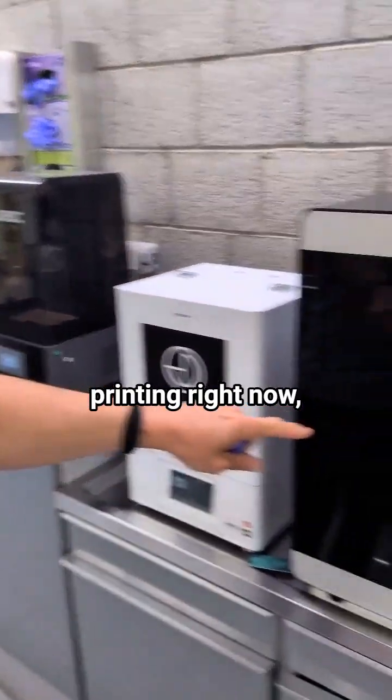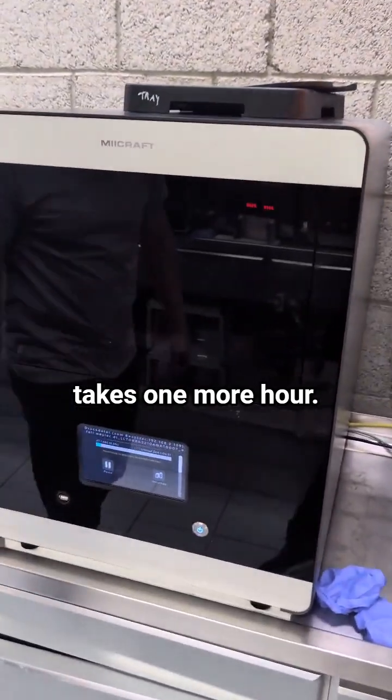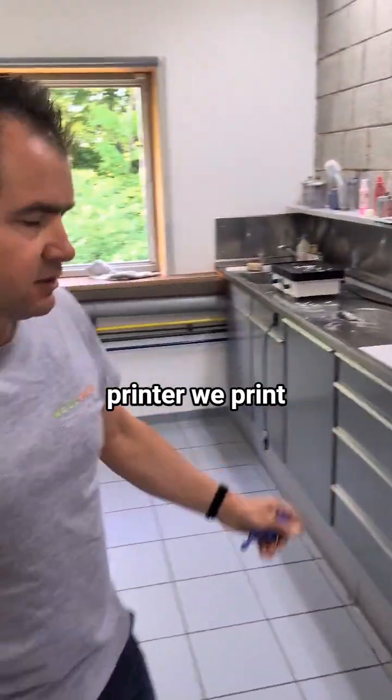There is a model printing right now — it takes one more hour. With this printer, we print all the different stuff.